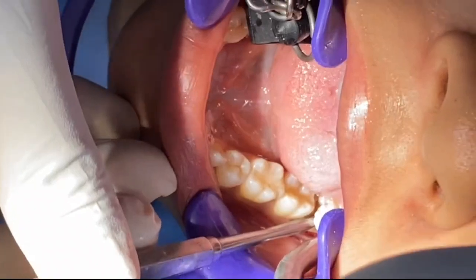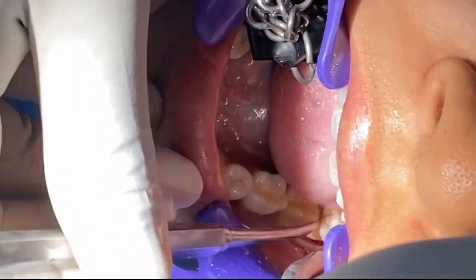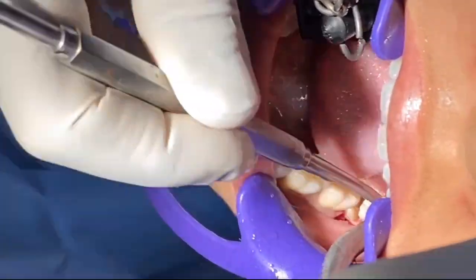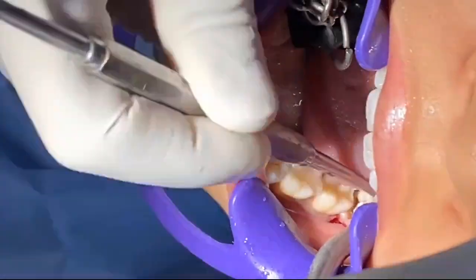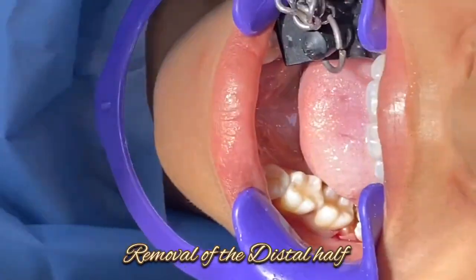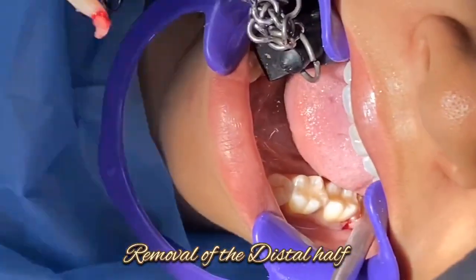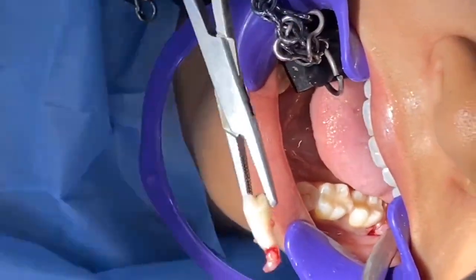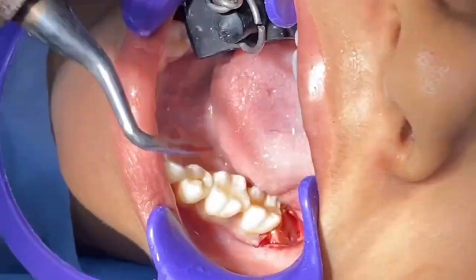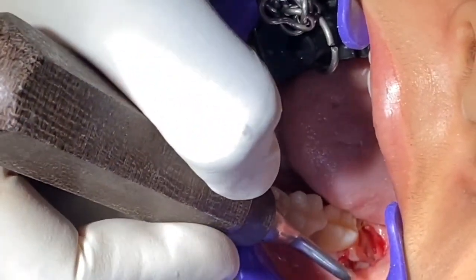Sectioning. Here I will be putting my periosteal elevator and try to do the purchase point here. This is a purchase point — we are already done.